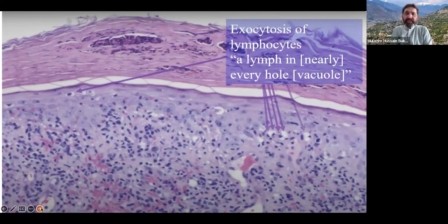And when such vacuoles are not seen around, this is a very important thing for the histopathologist to understand. Either it is a lymphoma, or it is pityriasis, or it is lichen planus, and also combine the other features. Don't confuse yourself with pityriasis or something else.